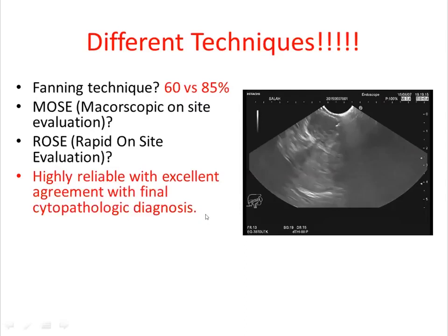And I need ROSE if the previous biopsy is negative and the patient came for another trial of EUS-FNA. Then I make every effort to provide a cytopathologist beside me for ROSE. So ROSE is very, very helpful if available.